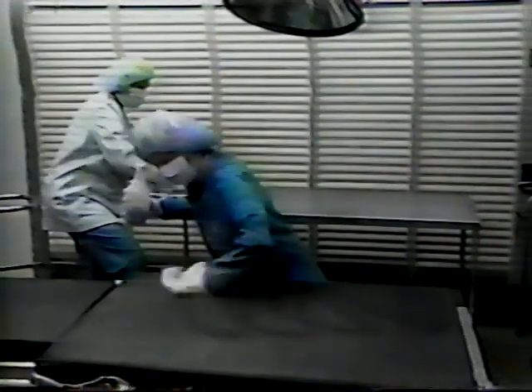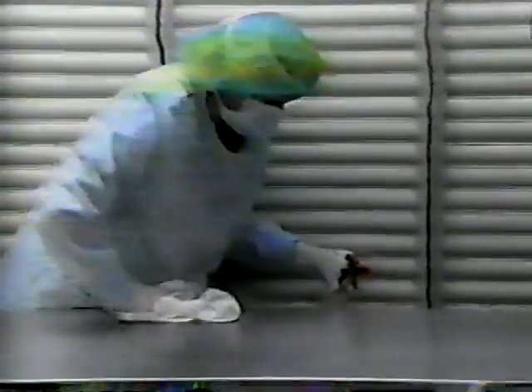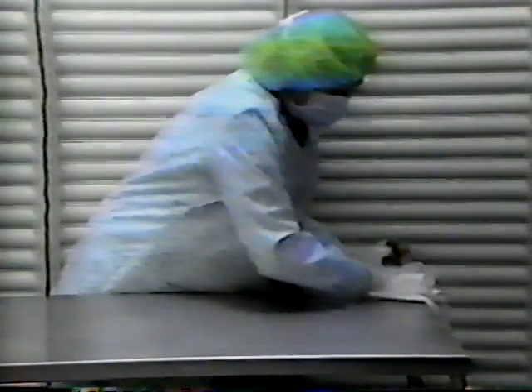Environmental sanitation is also a factor in preventing transmission of exogenous microorganisms. Germicidal cleaning solutions used in environmental sanitation destroy microorganisms. Germicidal chemicals that kill most viruses, bacilli, and fungi are called disinfectants. They are used on inanimate objects.